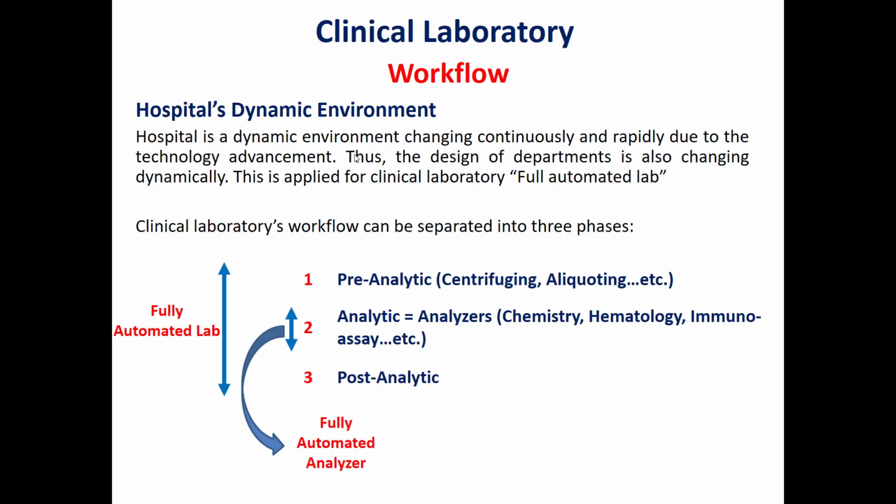Prior to starting with this background, I want to mention that a hospital is a dynamic environment which is changing continuously and rapidly due to the advancements in technology. Also, departments are considered dynamic environments which are changing continuously and rapidly. To demonstrate this, I will talk about the clinical laboratory. The workflow in a clinical laboratory can be separated into three phases: pre-analytic, analytic, and post-analytic.